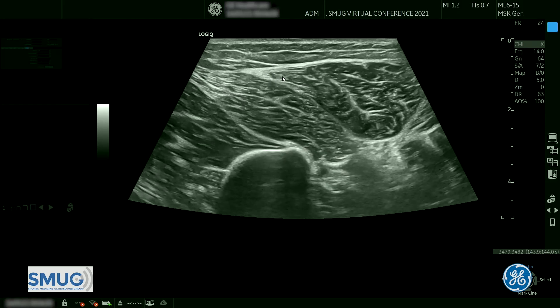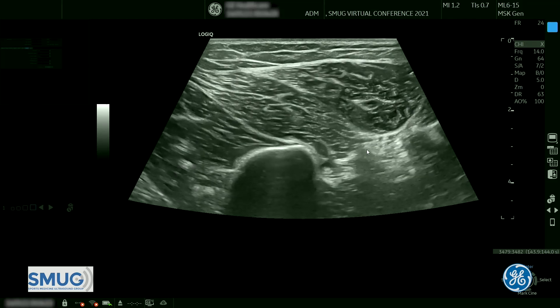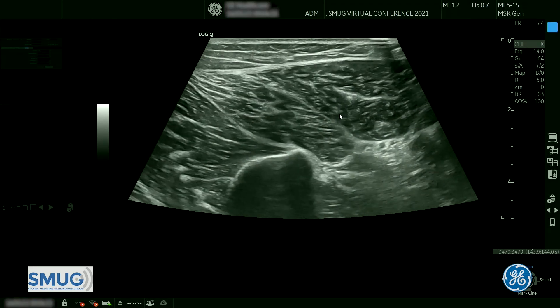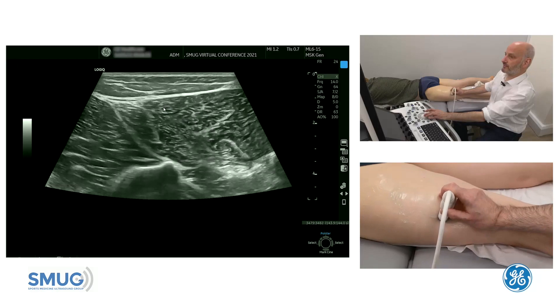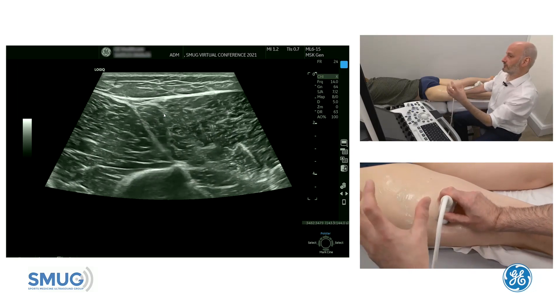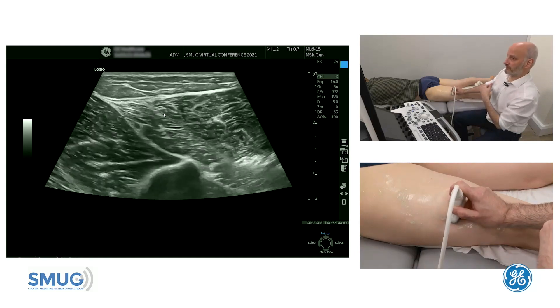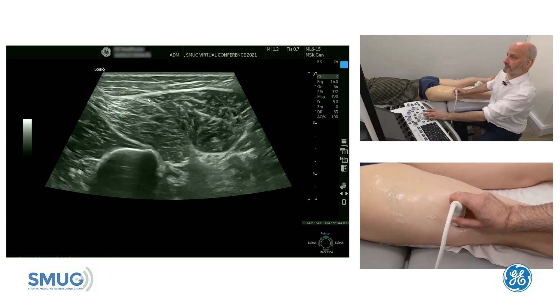If this is a big or deep injury, it's quite close to the sciatic nerve, so it's good to have the sciatic nerve there as a marker so you can see the injury in relation to the muscle. That's how we identify it. You have a logical way of always finding the short head — follow the muscle from the proximal start of the short head all the way through to the T-junction. That way you get all the information as you get to that point, and you have a reliable method of always being confident to end up scrutinizing that T-junction carefully.